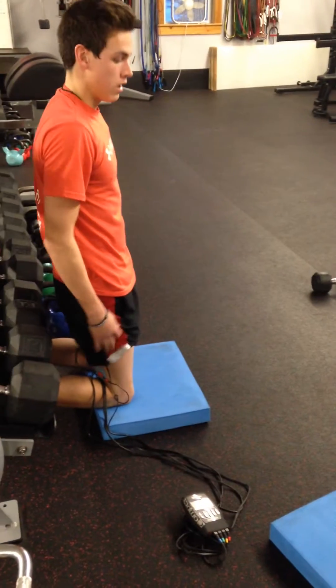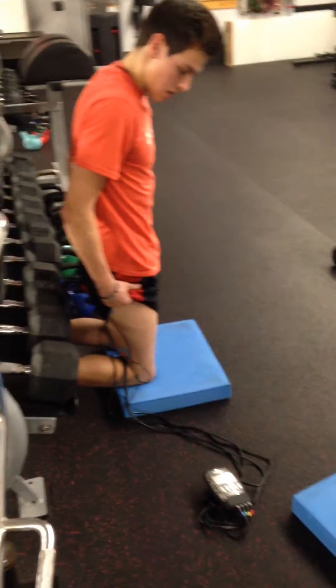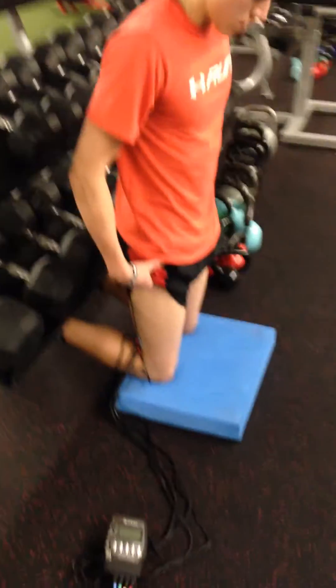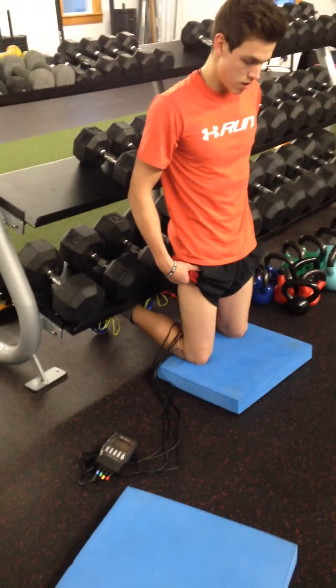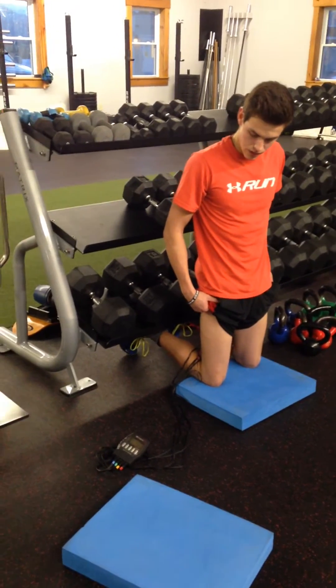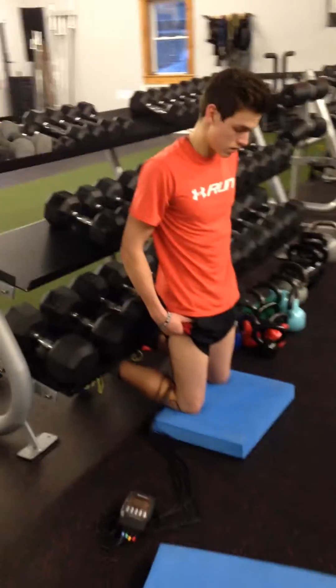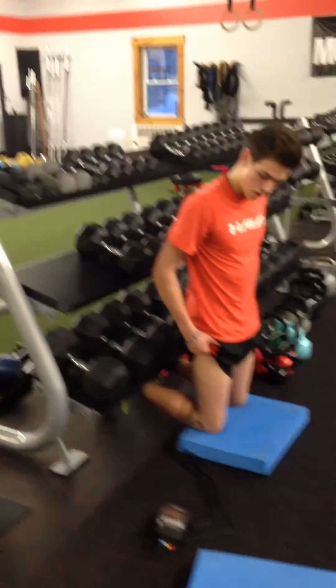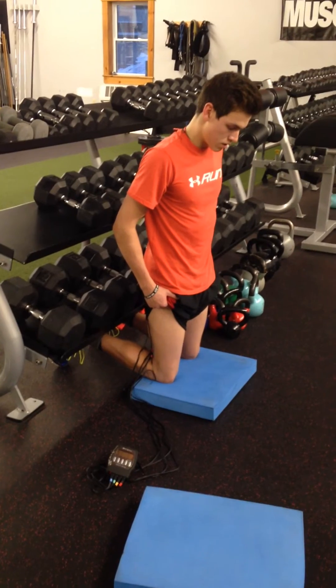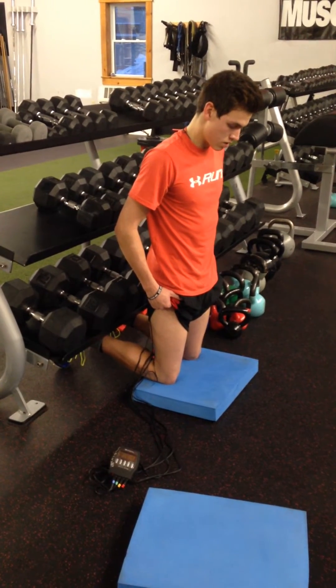High school athlete here. We're rehabbing from some chronic hamstring strains. It's cross-country season, and we're using our Compacts unit to help facilitate trying to mobilize some of that scarring he has from some of those strains.